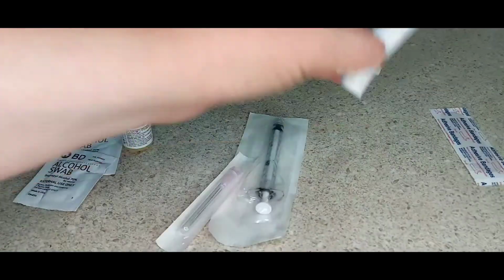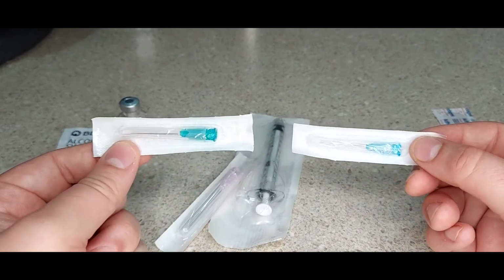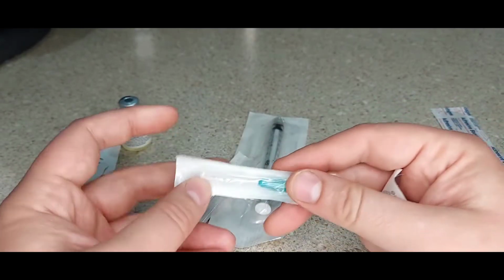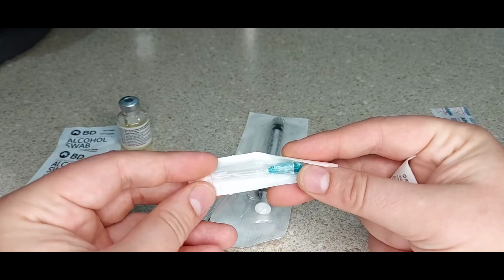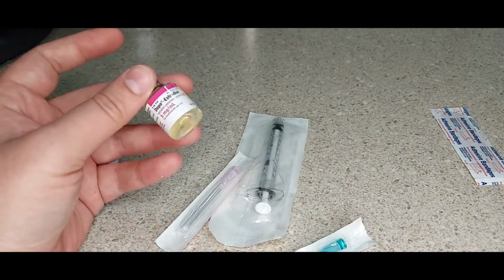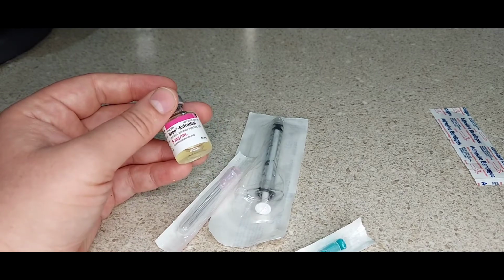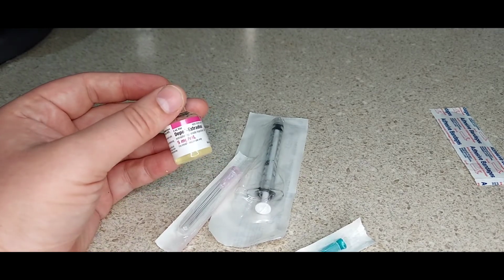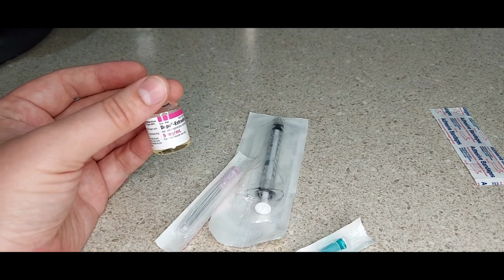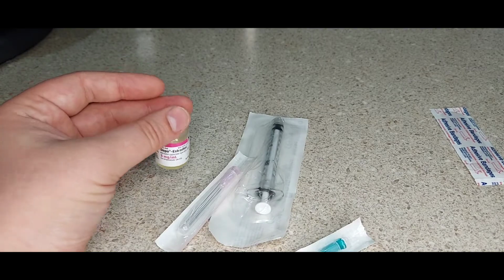You may be asking, hey Roz, why do you have two different needles? You may see that they are slightly different sizes. This one over here is a 23 gauge. This is what the doctors will most likely give you. This is what they gave me at first. A lot of depot estradiol, the label says to go by intramuscular, but a lot of research is showing that subcutaneous is actually, I don't know if better, but there are benefits to it, and so my doctor is having me do subcutaneous instead of intramuscular.